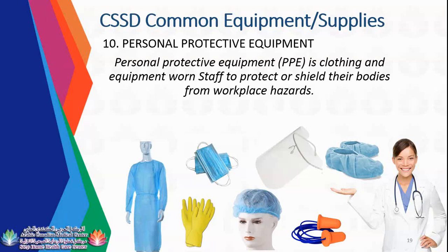For us here, as you can see, there are gloves intended for CSSD, which are very long, until it covers until the cuff of the gown. So utility gloves plus nitrile gloves, mask. Actually, mask. I still put mask, but as per the new updates, it should be respirator, or the N95 mask. The reason why it should be a respirator is that you are using hazardous chemicals.